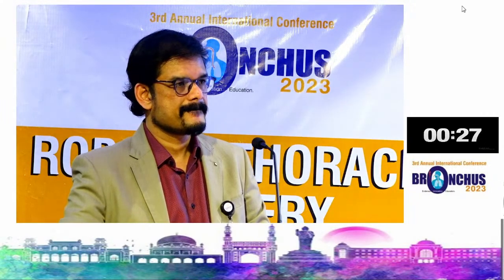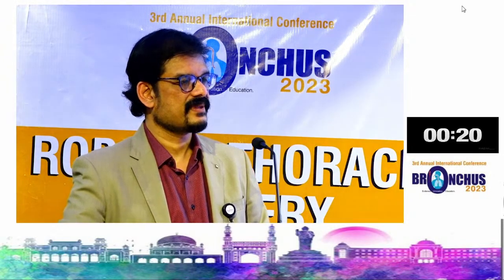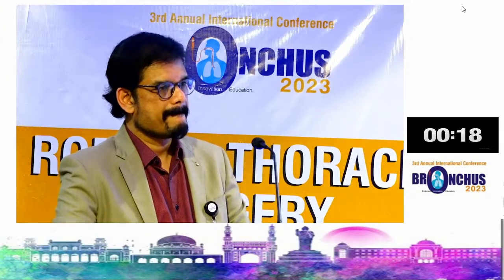Basically, we here have a trained robotic nurse and a technician who handle the basic things. And as per the operating team, your on-table assistants change. So when Dr. Bala operates, his on-table assistants are from his team. When I operate, I have my residents or somebody. But the robotic nurse and the robotic technician who set up are common. But on-table procedures, obviously he can't trust anybody else to put a stapler on that.